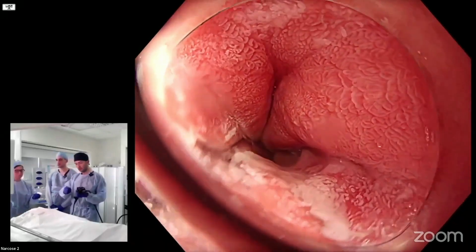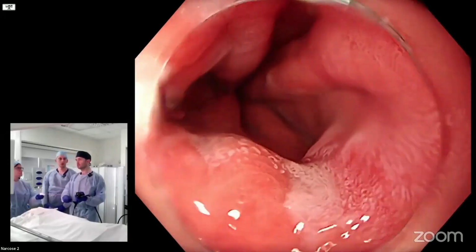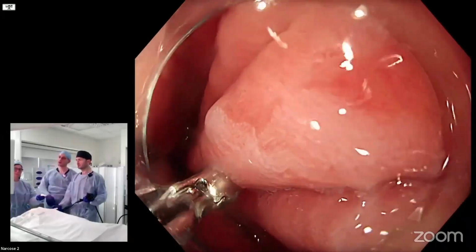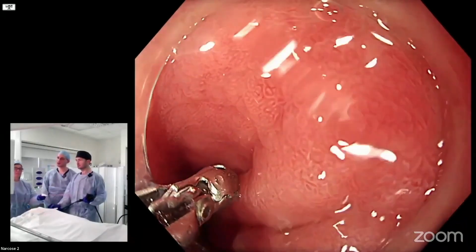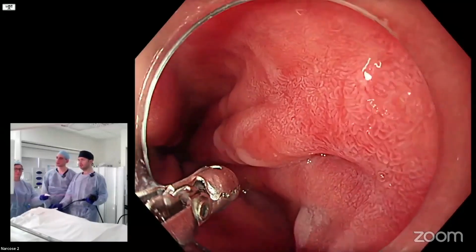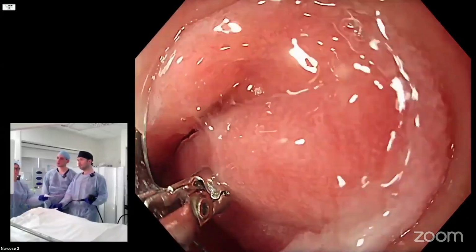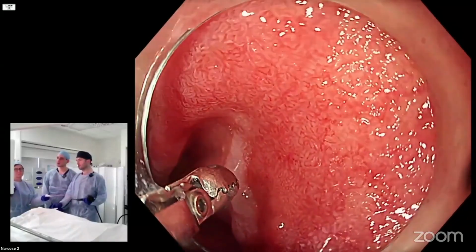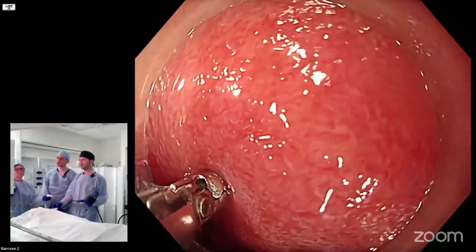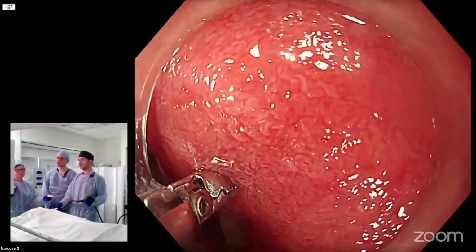Okay, so where do we start the biopsies, Michele? I would start at the GOJ. And where is the GOJ? We have seen it pretty well with the top of the gastric fold and the palisade vessels. So around about here, right? In this zone, okay. I think that in this zone, if you really use the insufflation, you can clearly see, you can get the cap in there to really pull back on it. So this here, this is the GOJ, right? This is a GOJ. And you see the gastric fold ends here, but it's actually this zone which you're particularly interested in.